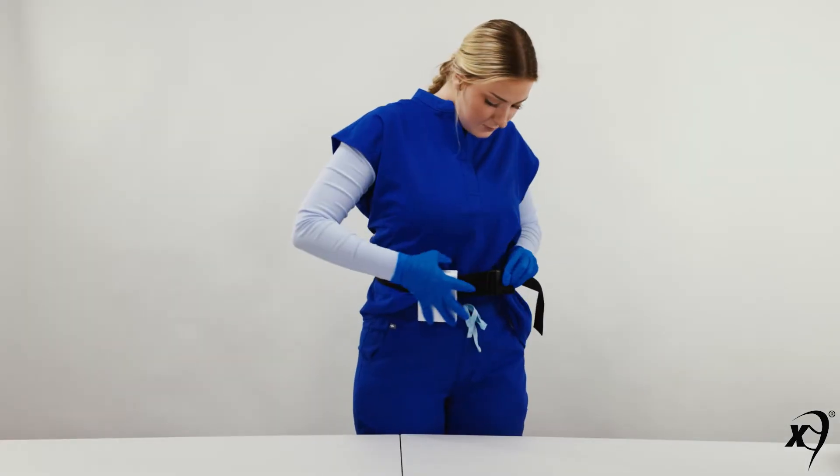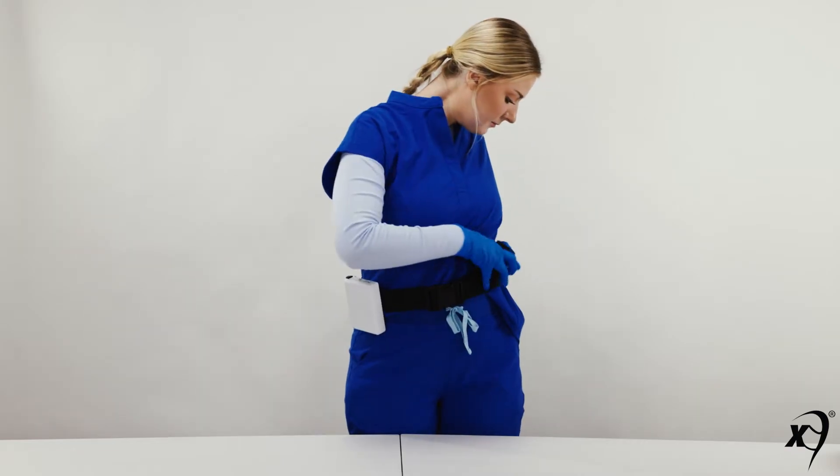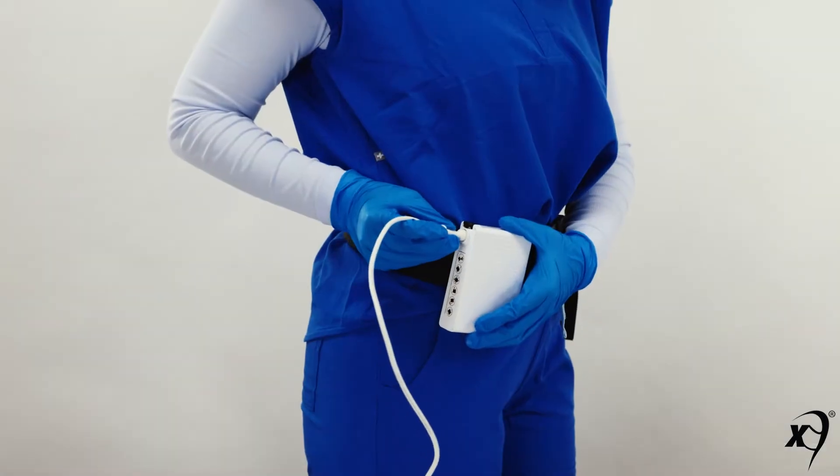Let's begin. To begin, don the MaxAir belt with a fully charged MaxAir battery. Plug the power cord into the battery.